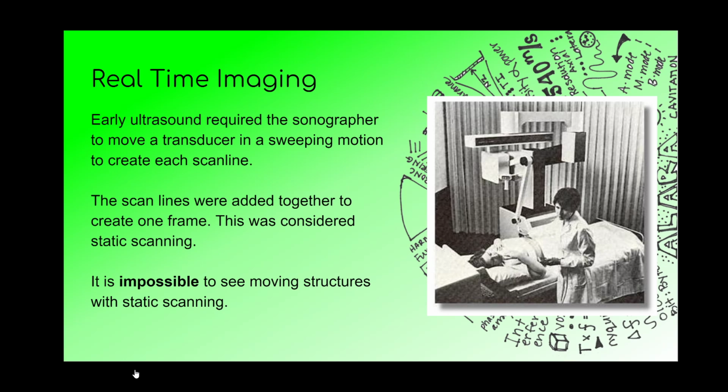And so with real-time imaging, we get to see as structures move within the body, are they moving appropriately? We get to see where we're headed with our transducer, and that's awesome. Because when ultrasound originally started, not as awesome.